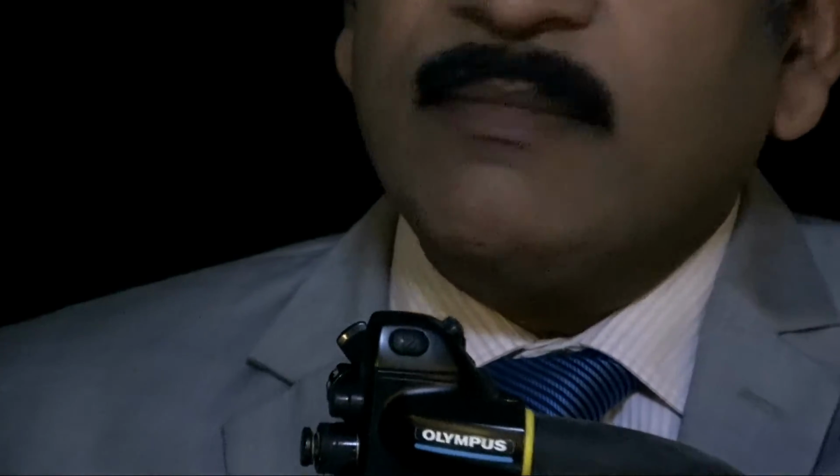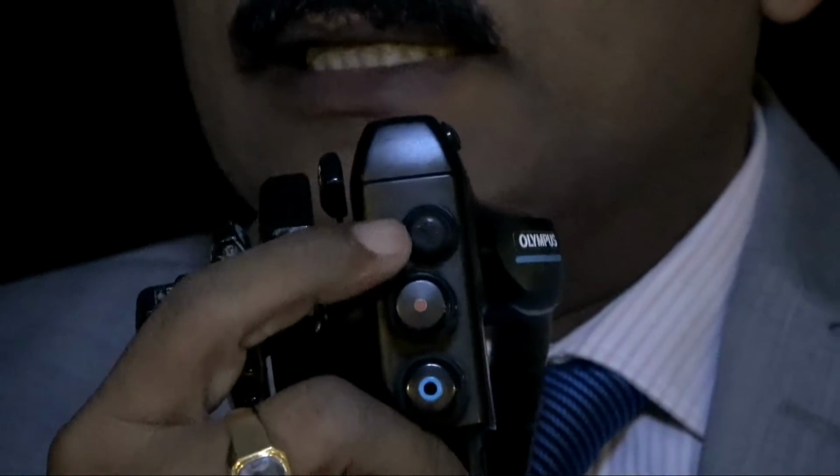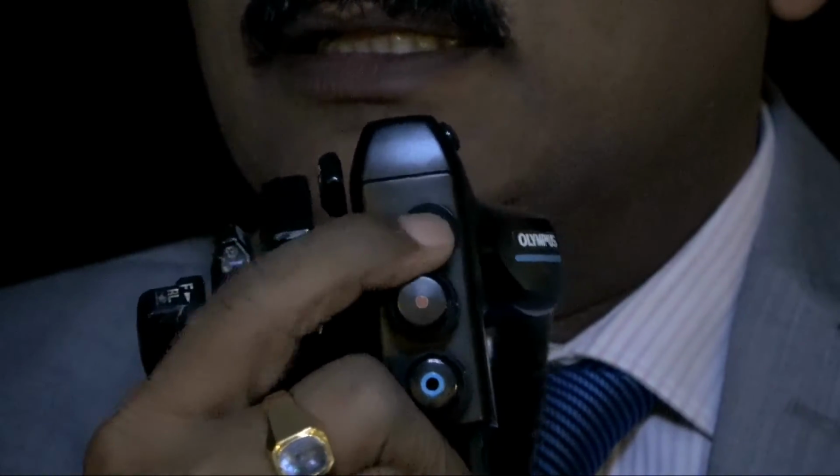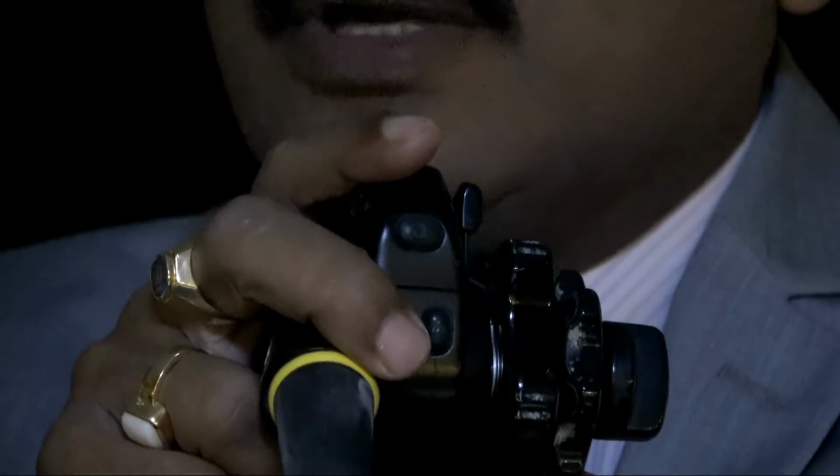How to program? I will show you right now how to program. These are the buttons. Programming I will show you once I finish the lecture. Then see, here it is written number 1. Can you see that? This is 1. Here is written number 2. Here it is written number 3. And here it is written number 4. So these are the 4 digital buttons.